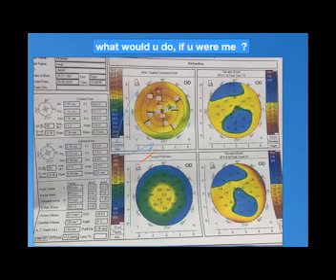Well, I think if you remember that I said at the start, correlate the anterior elevation with the posterior elevation. If they are both high, consider. If they are not, don't consider, and think of other reasons for that. I'm waiting for your diagnosis and decision.